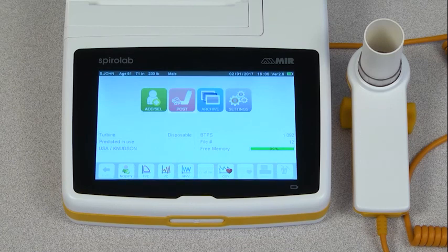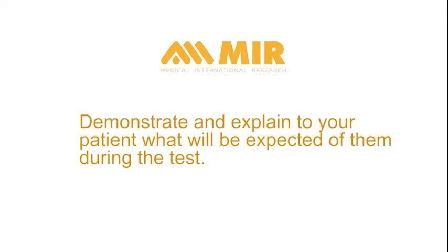This brings you back to the main menu, where you will select the test you want to perform from the icons on the bottom row. Before beginning, take time to show and explain to your patient what will be expected of them during the test. This will ensure that you get the best possible results.